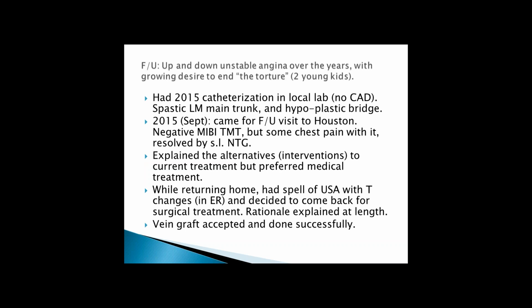So he came in September this year, and we saw another angiogram that was done recently in Arkansas, where he was coming from, that showed the spastic left main and hypoplastic bridge of the proximal left main.